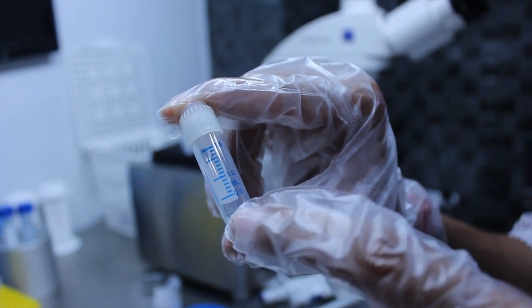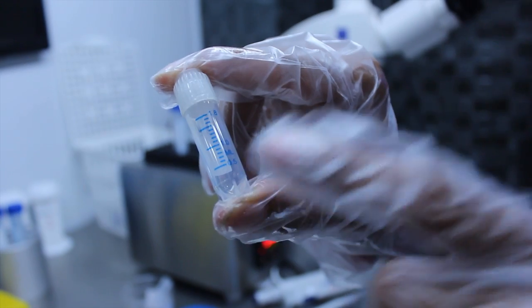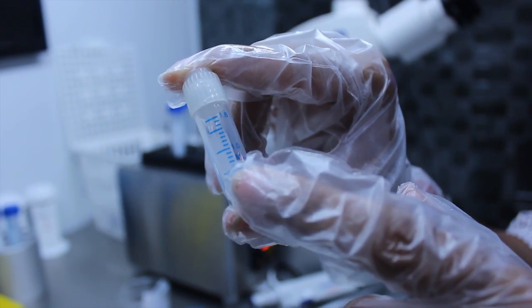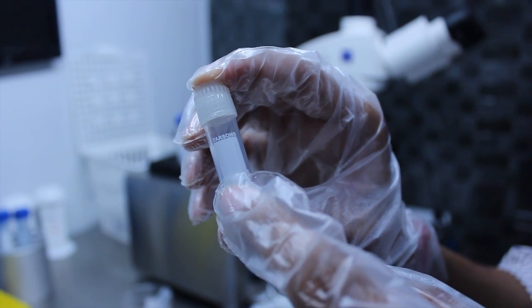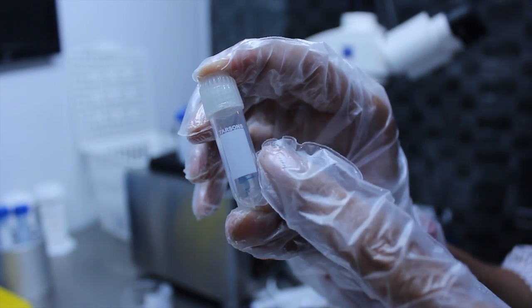This is a semen freezing vial. The sample mixed with freezing media is put in this vial. The vial needs to be marked properly with the patient's name and ID and the date of the procedure.